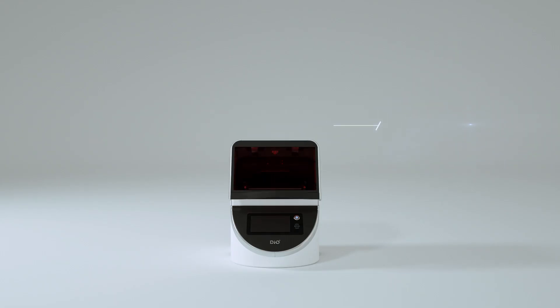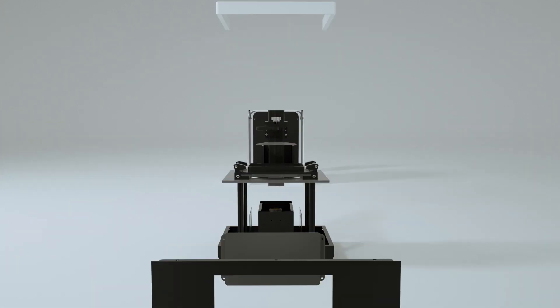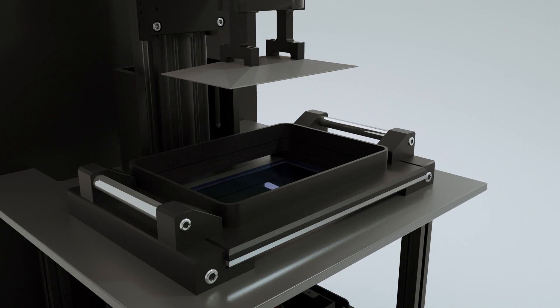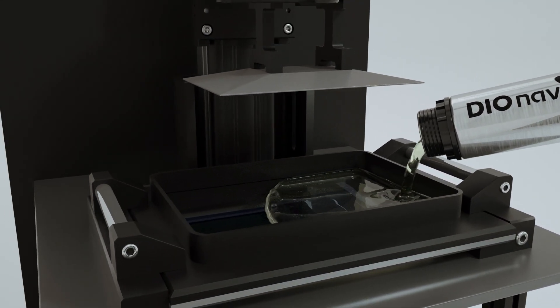The semi-auto door is easy to handle and needs minimal force. Maintaining a vat gets easier and faster. It's important to keep the vat clean, and it shouldn't be a burden.